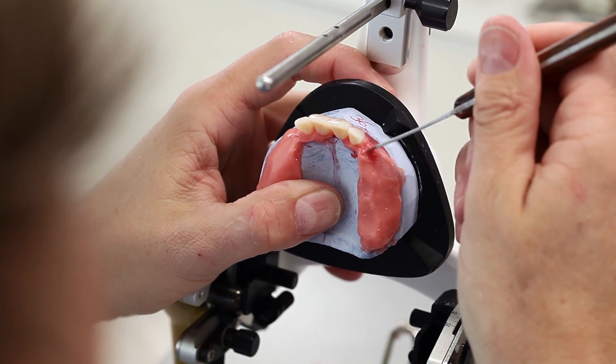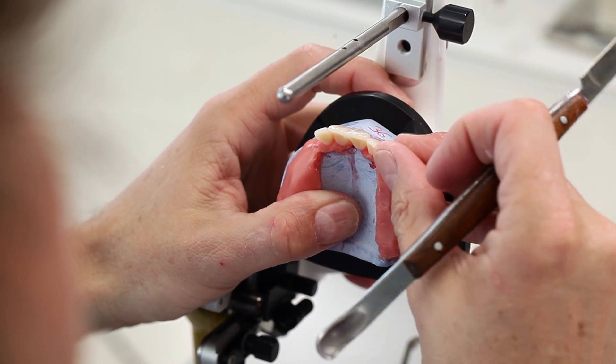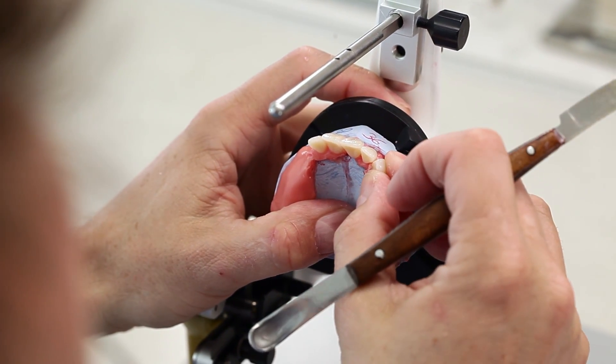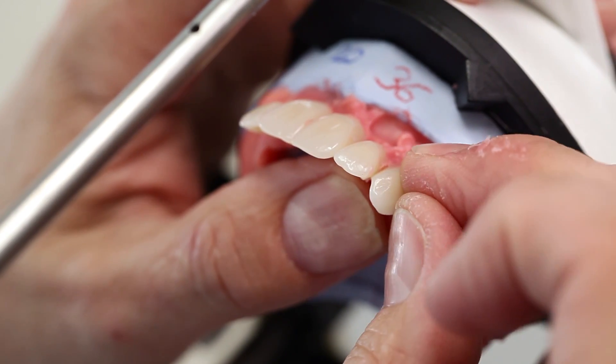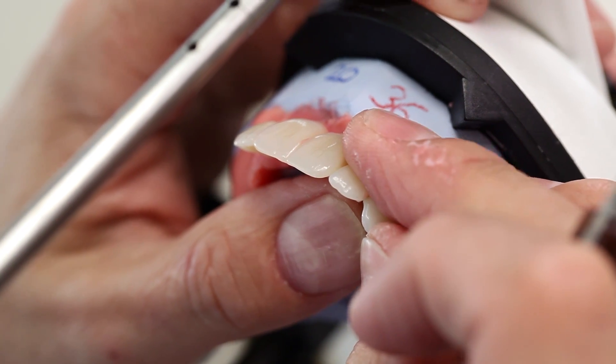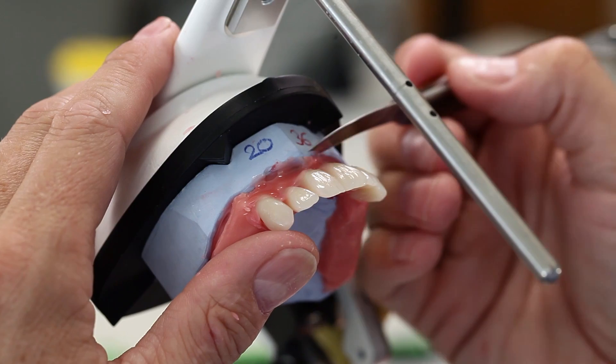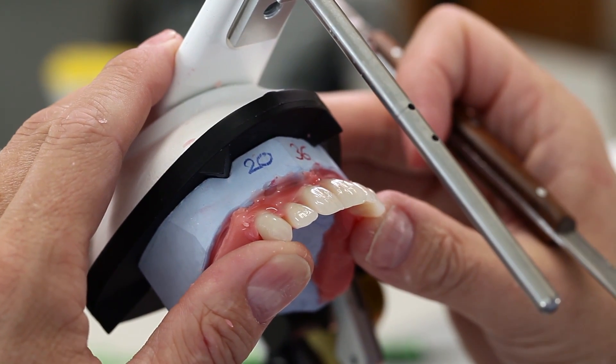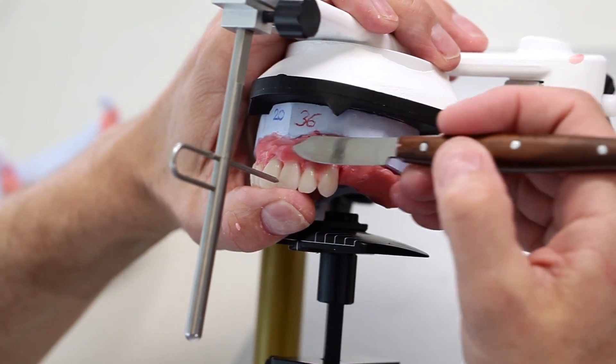The position of the canines is of decisive importance for the function and aesthetic appearance of the setup. The symmetric positioning of the canines, the most distinctive teeth in the maxillary anterior region, facilitates the setup. The canines are again set up perpendicular along the longitudinal axis. Ideally, the distal ridge runs parallel to the sagittal course of the alveolar ridge. After the setup of the maxillary anterior teeth, they can be checked using the setting up template.